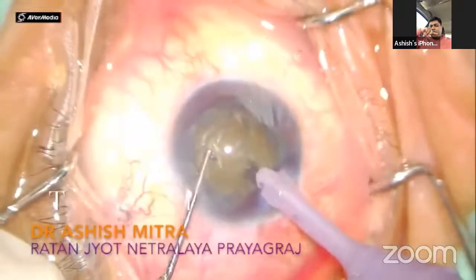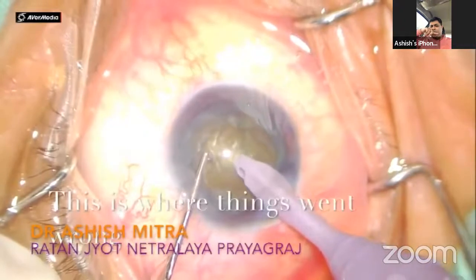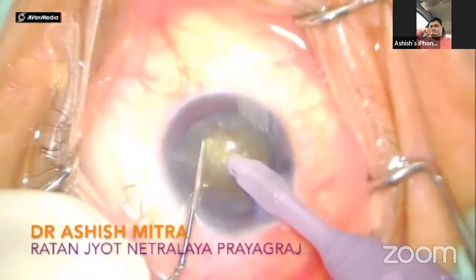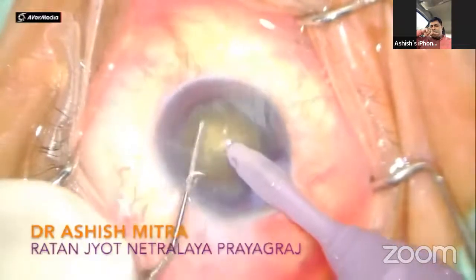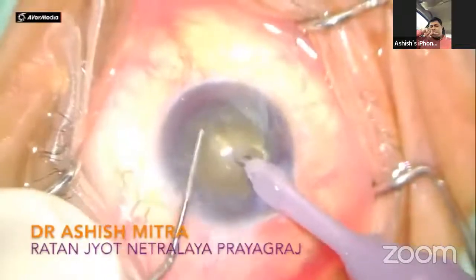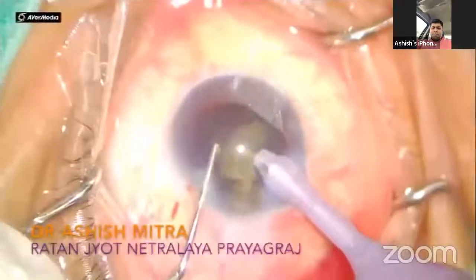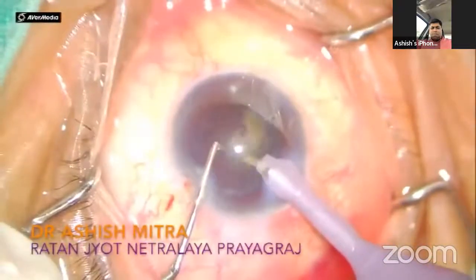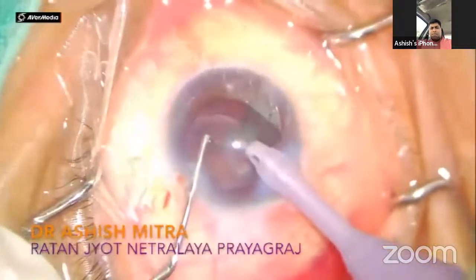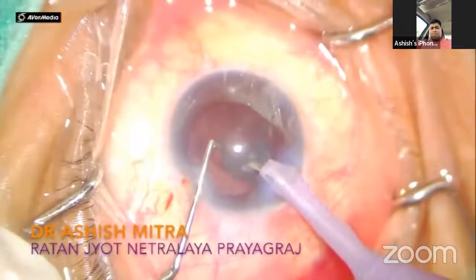Now see, I would be trying dry chop. The tip exposure is seen beautifully. I buried the whole of my tip into the nucleus, and when I tried to chop, there was rotation of the nucleus with the bag itself. See again, this is a slow motion video. Again, when I tried to chop, there was rotation of the bag, and probably this was the moment where I had that zonular dialysis.